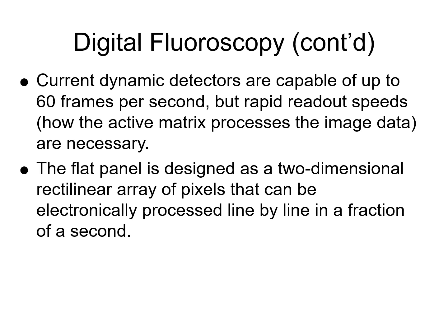The computer can read out 5 billion pixels per second, because that's a simple computation. Tell me what the intensity of this little square is. Read out the stored charge. That's a simple thing, to the computer as simple as calculating 2 plus 2. And so even with a 1000 by 1000 pixel matrix, 1000 rows, 1000 columns, it's 5 billion versus 1 million. 5 billion in a second.